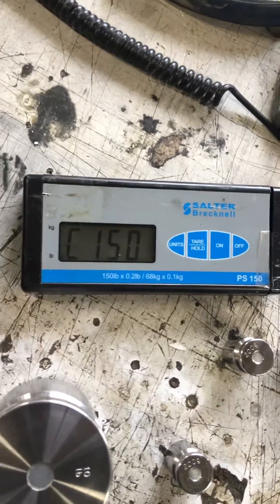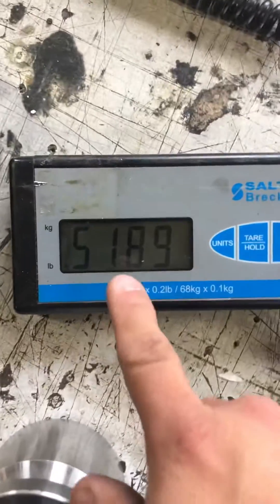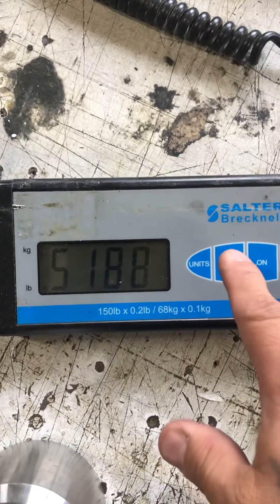It shows C150 and pounds. So you're going to press here to zero that, and then from there you're going to add what that C number was, which was 150.